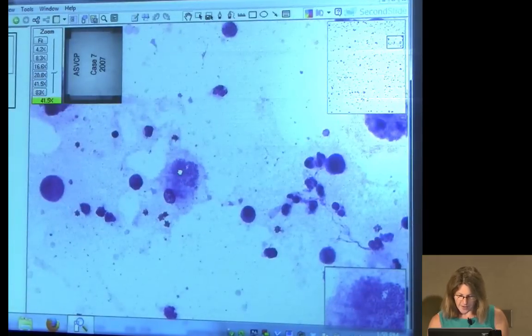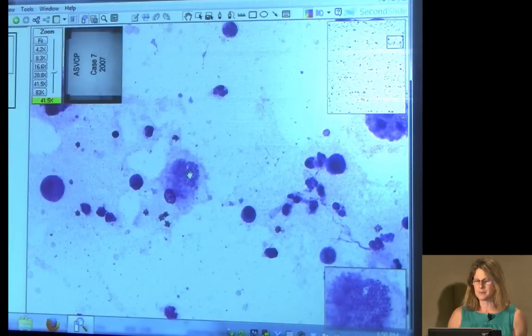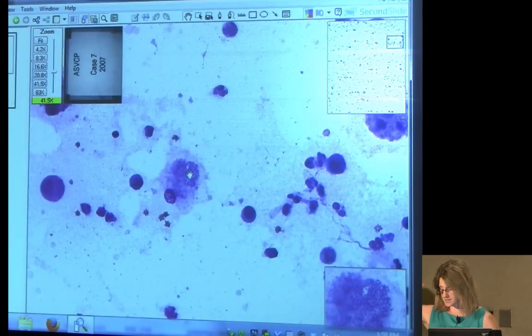Okay, actually there's even better. So you've got something in there. So this is not stain precipitate. On our stain, bacteria are blue, and stain precipitate's purple. So there's a definite color differential. The other thing I look for with stain precipitate, it's often out of the plane of focus of the smear. And if it's in focus and it's in the same plane as everything else is in focus for the cell, then I'm more concerned that it's truly not stain precipitate.